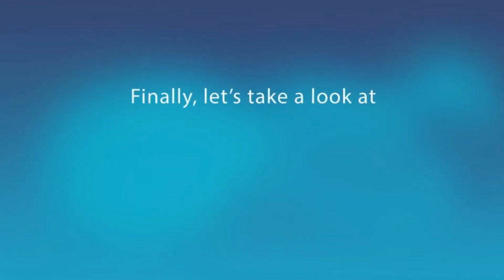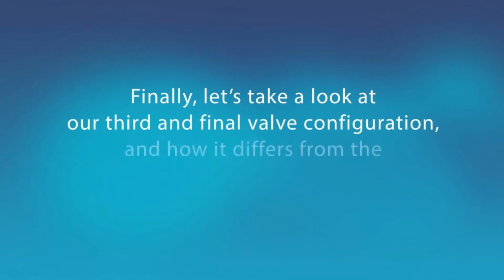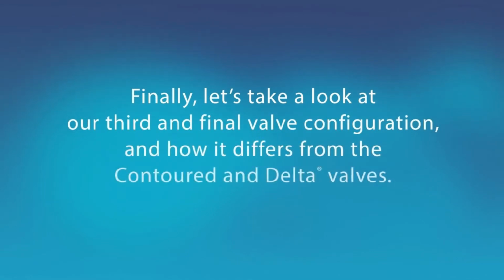Finally, let's take a look at our third and final valve configuration and how it differs from the contoured and delta valves.